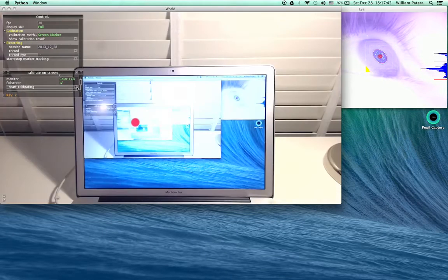What I'm going to do is look at the target as it moves through the screen. When the red dot in the center is on, it's not collecting data. When it's green, it's collecting data. I'm trying to keep my head pretty still and just move my eye to the marker.